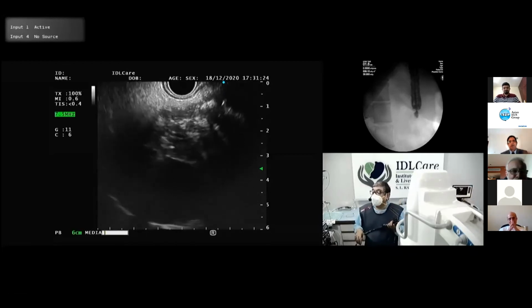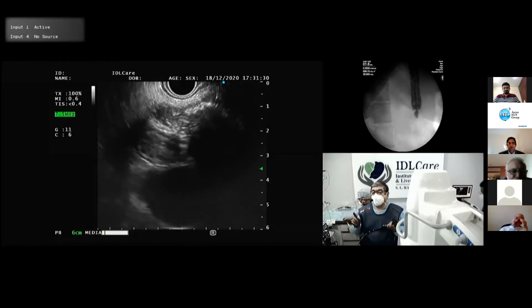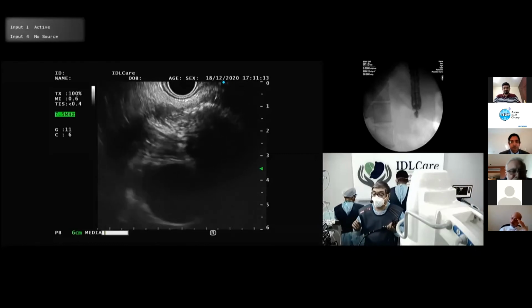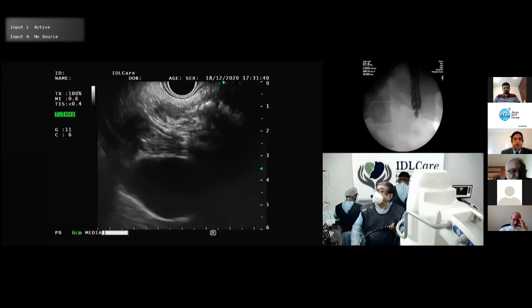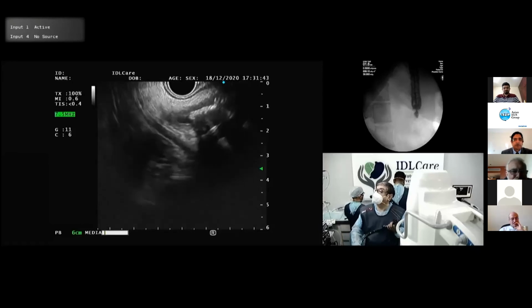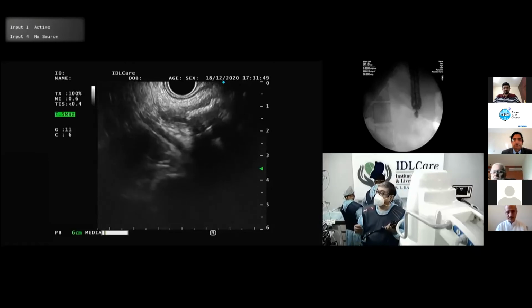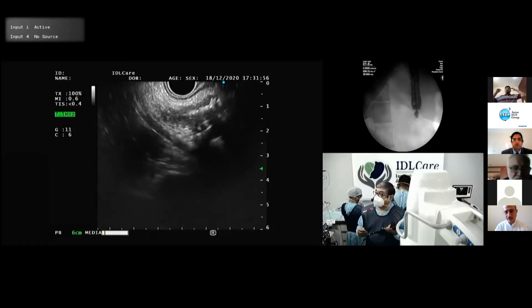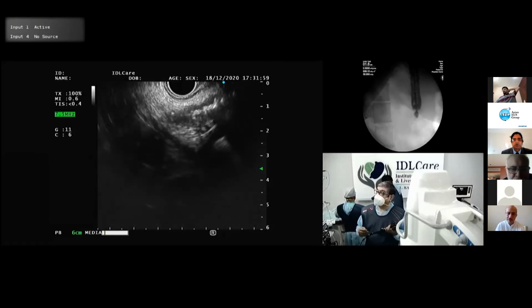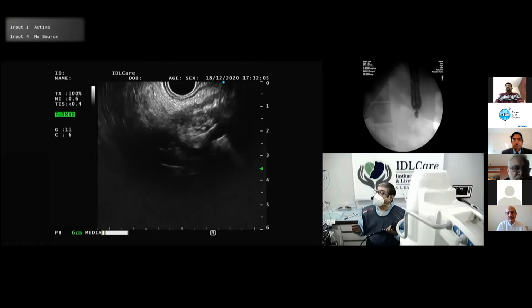And I tried 018 in a few patients. It doesn't last even half the procedure. It is very soft at the tip and it completely coils and finishes off. So, very delicate wire. I have been asking these VisiGlide guys to make something in 018 because that will be useful not only in the pancreatic duct but also in the bile duct. Because when you do hepaticogastrostomy, sometimes the intrahepatic biliary radicals are not very dilated. In that case, what you say is true. You put in a small needle and inject so that they become big and then pass a very thin wire.